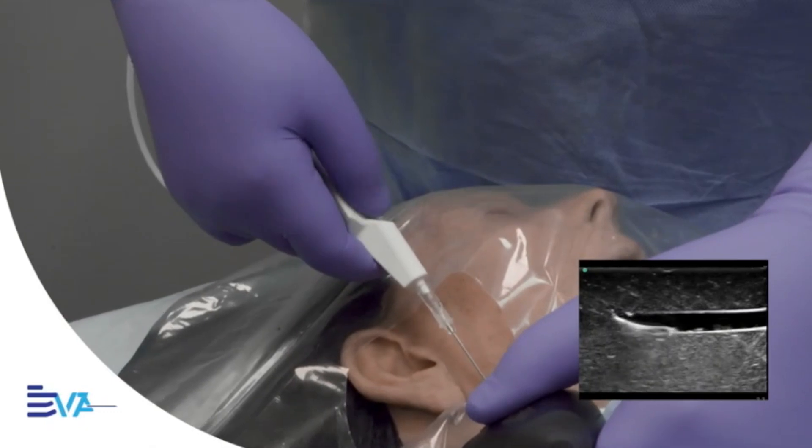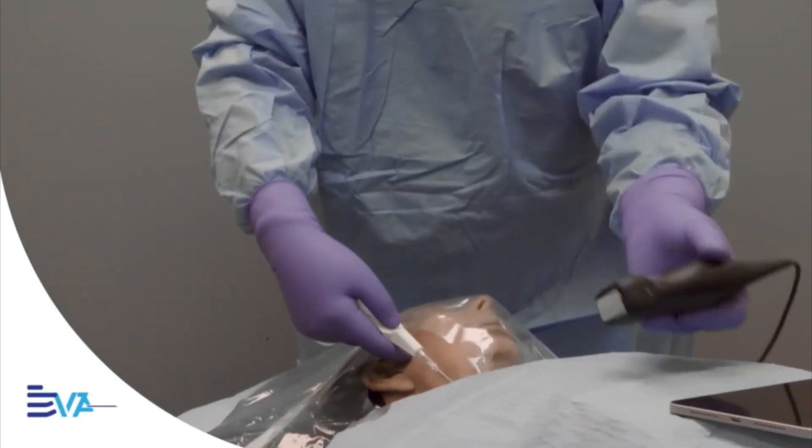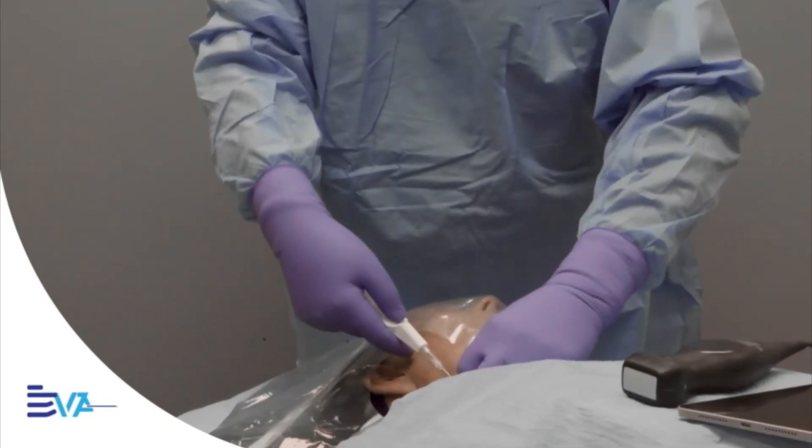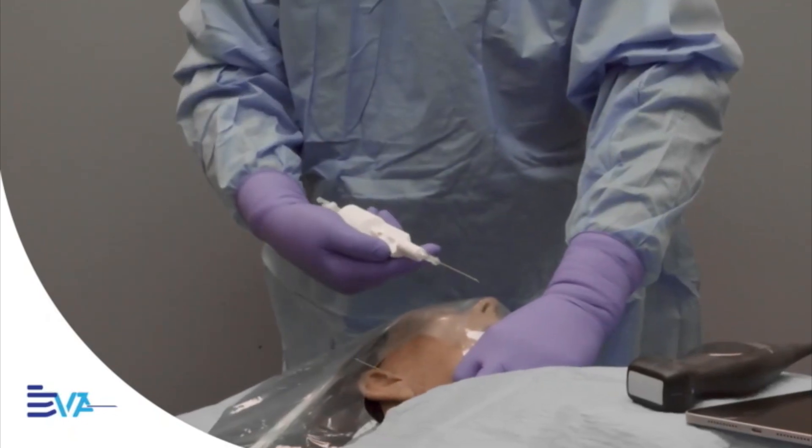This is the next step in vascular access. Less stress, more control, better outcomes. No more uncertainty — just confidence every time.